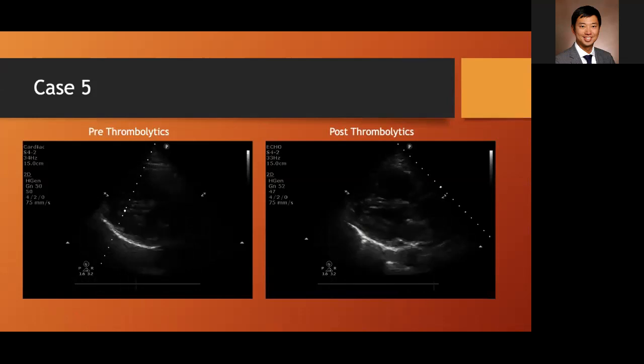Yeah, no, that sounds appropriate if it's kind of a more urgent and deteriorating situation. But at our institution, we have the ability for AngioVac, which is basically a venous bypass circuit with a filter. So basically, you just take blood out of the right atrium, maybe into the right ventricle using this catheter, and then that just kind of sucks the clot in, and then it gets trapped in this filter system.